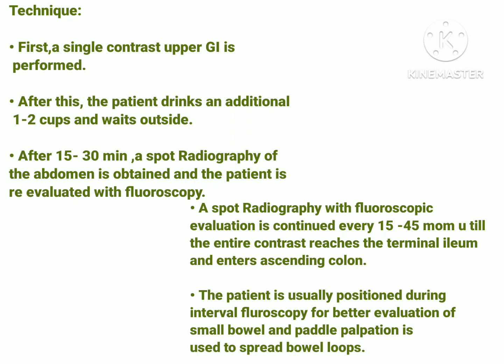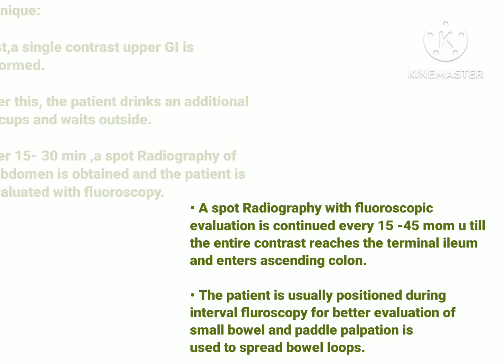We can evaluate the patient with fluoroscopy to check the contrast when it reaches the terminal ileum and enters the ascending colon, so as to take the next spot radiography of the abdomen where we can evaluate the terminal ileum and ascending colon. So after the next 15 to 30 minutes, we will take the next spot radiography.